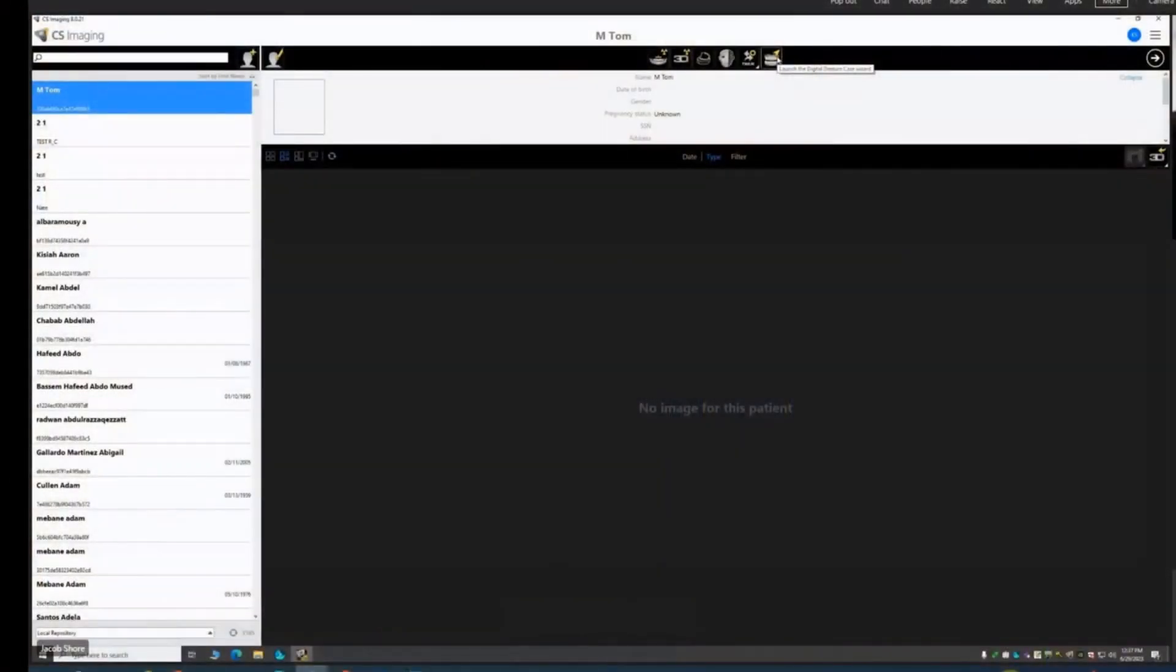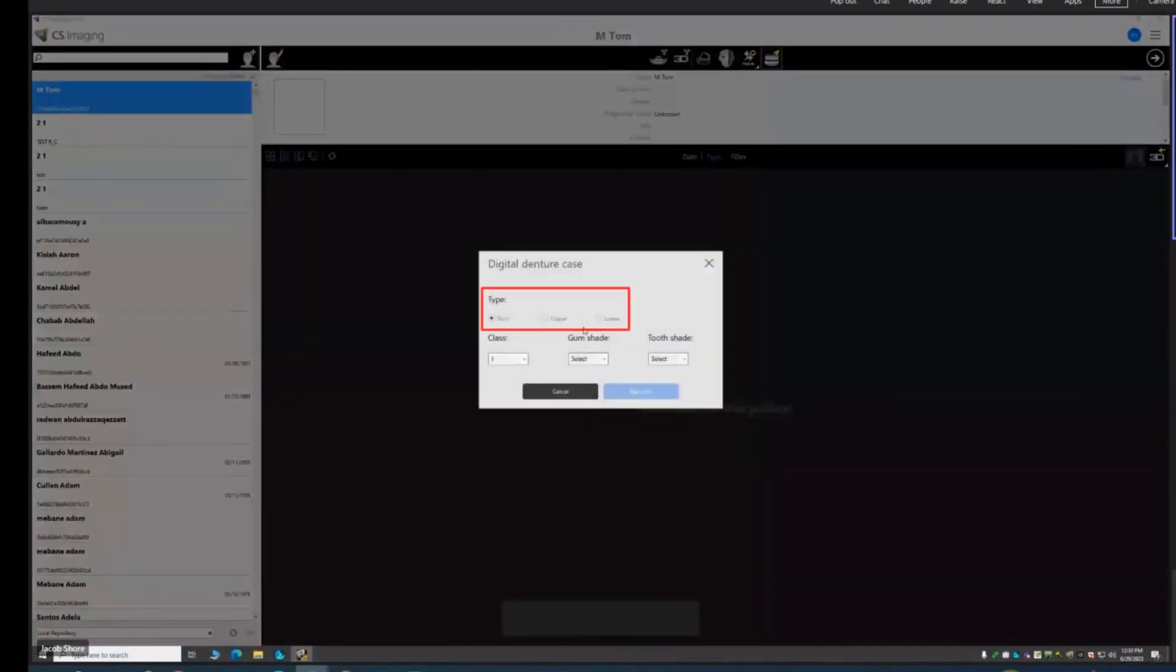Next, access the patient's chart and open the Digital Denture Case Wizard. In the Digital Denture Case, you must select either both arches, the upper arch, or the lower arch.